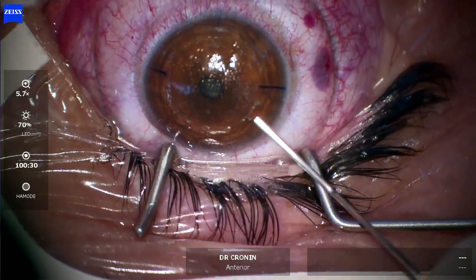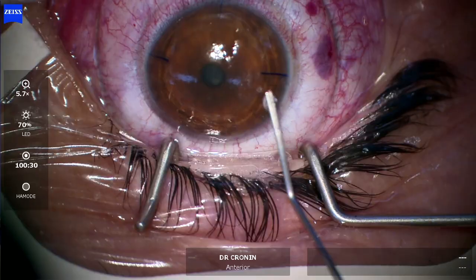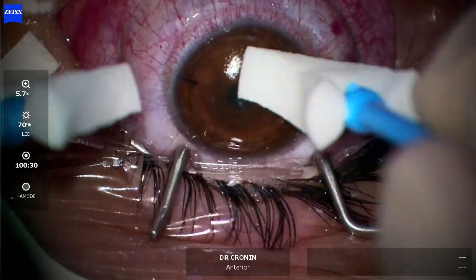That's put on the cornea and flattened out. Wash inside the interface to remove any debris, and then a massaging — as you can get folds in Bowman's membrane, this avoids that and leads to a faster visual recovery.